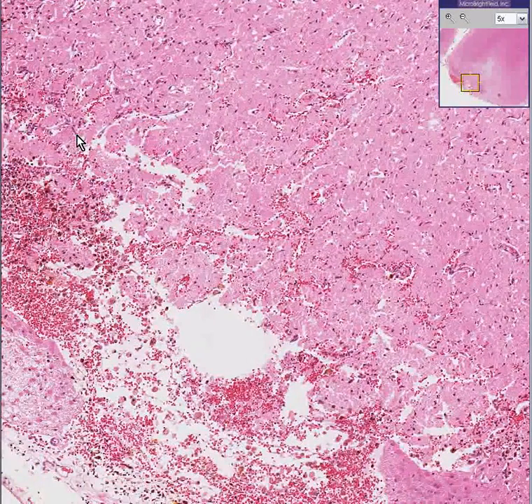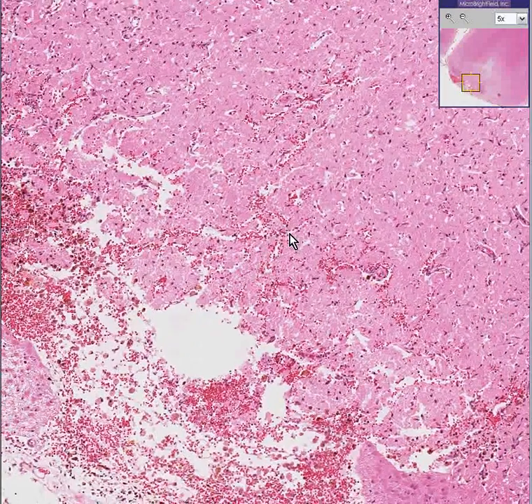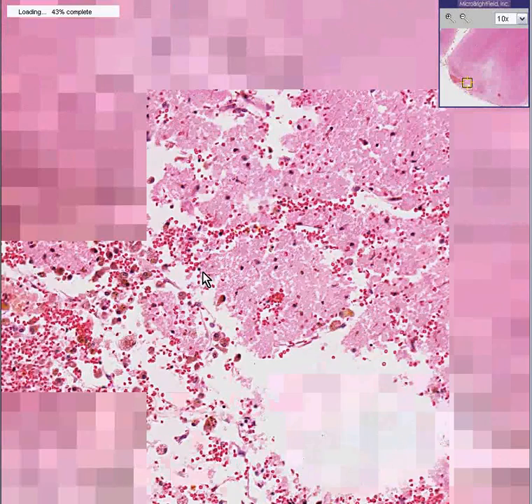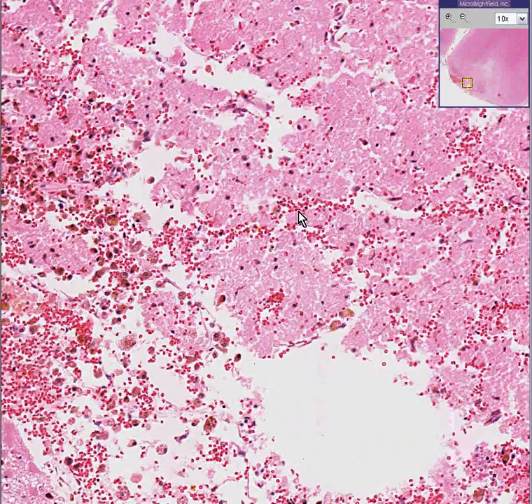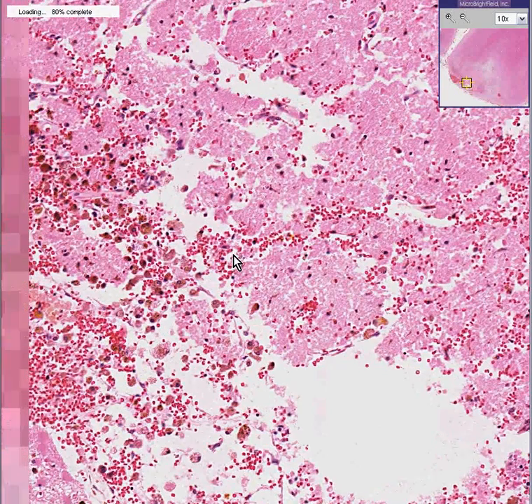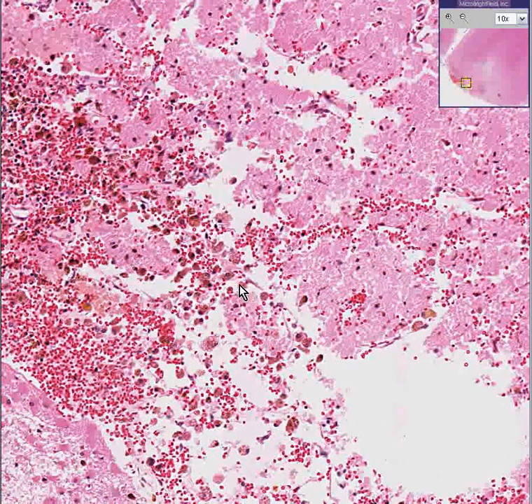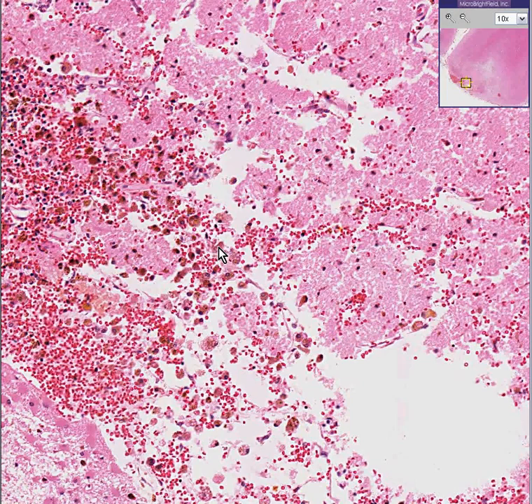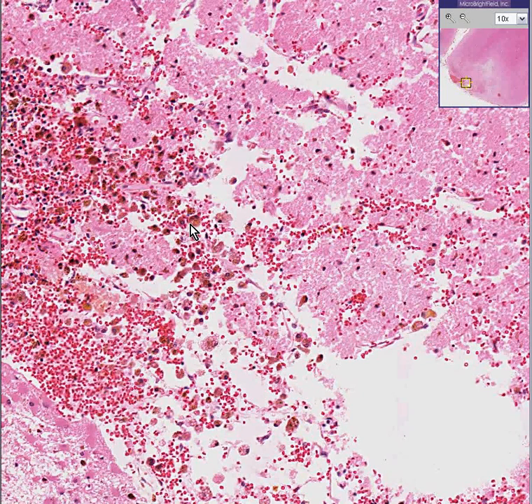This is acute hemorrhage dissecting into the brain. As you can see, there is no real reaction in this area in terms of gliosis, but you can see that the hemorrhage was there long enough to have evoked these macrophages taking up the golden brown hemosiderin pigment. For that reason, this was called a subacute contusion, about a week old.